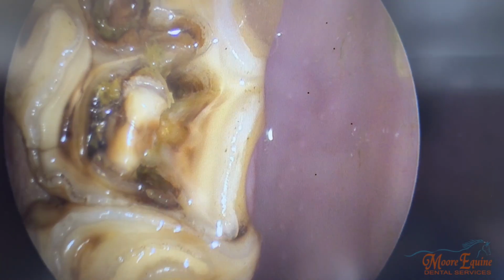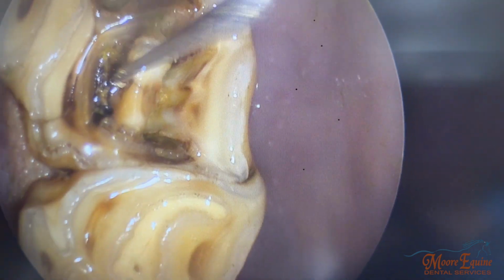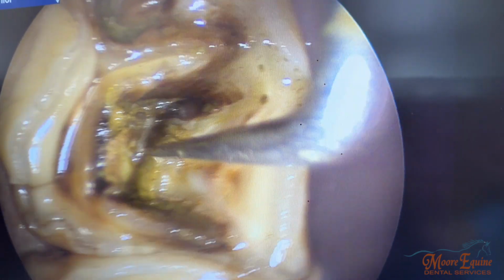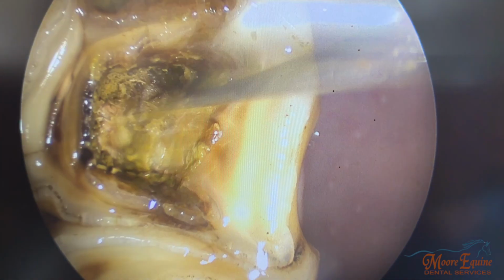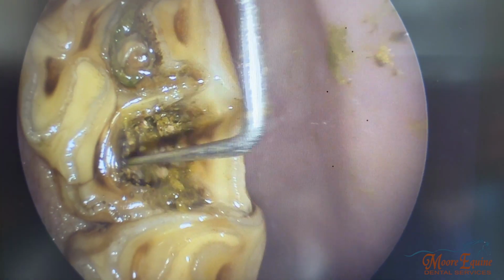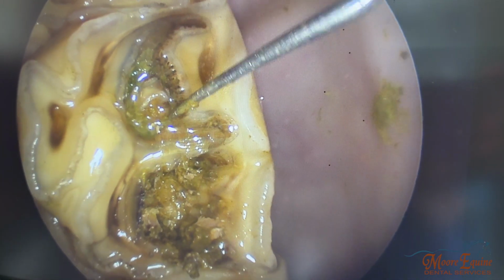We've cleared out some of that food, and now we can see this piece here that was broken falls out, and now we can see how the rest of the caries here is exposed. And so we're going to clean all of this out, and then we can restore this tooth. So this whole center of the tooth here is totally hollow, and a similar thing is happening here.